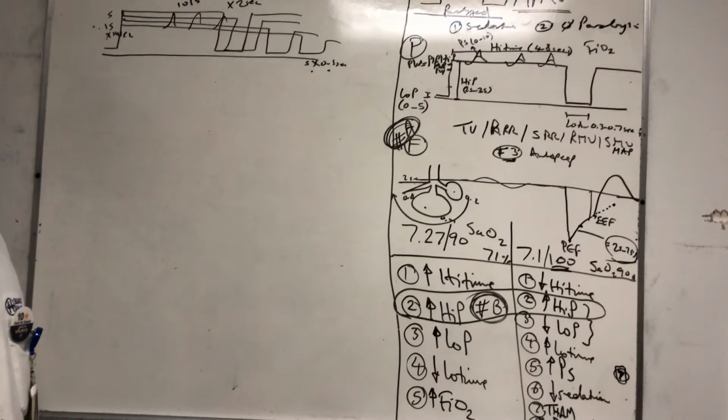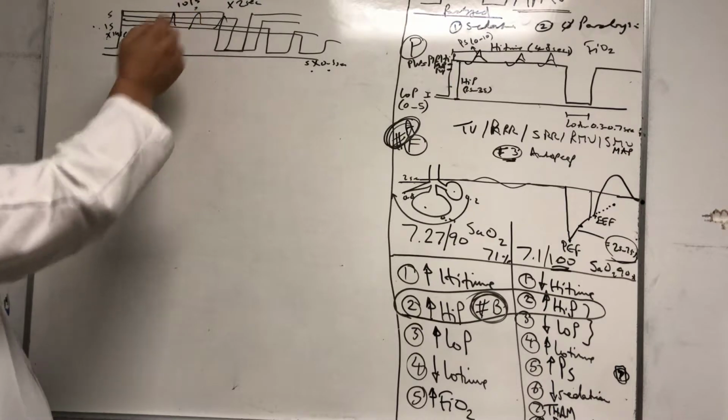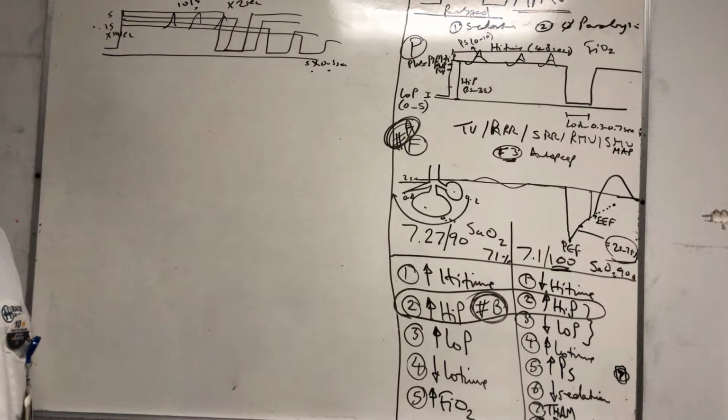I mean, it's almost the same as like a PEEP of 15 and the other pressure of 25. No, it's not 25, it's pressure support of 10. Yeah, it's just on top.